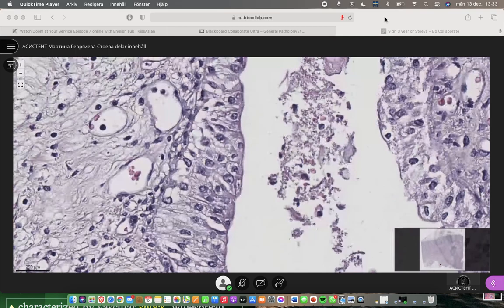You know that the calyxes, pelvis, ureters, urinary bladder, and the upper 2/3 of the urethra, all of them are lined by transitional cell epithelium. There is fat tissue from the hilum, of course, and large blood vessels again from the hilum.